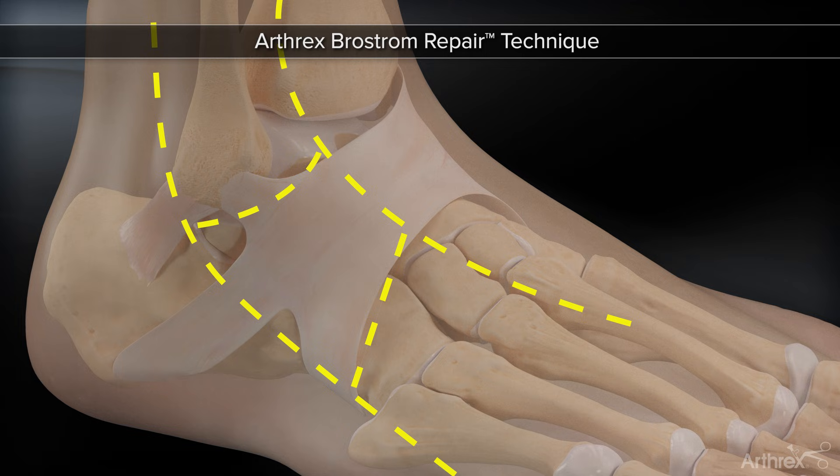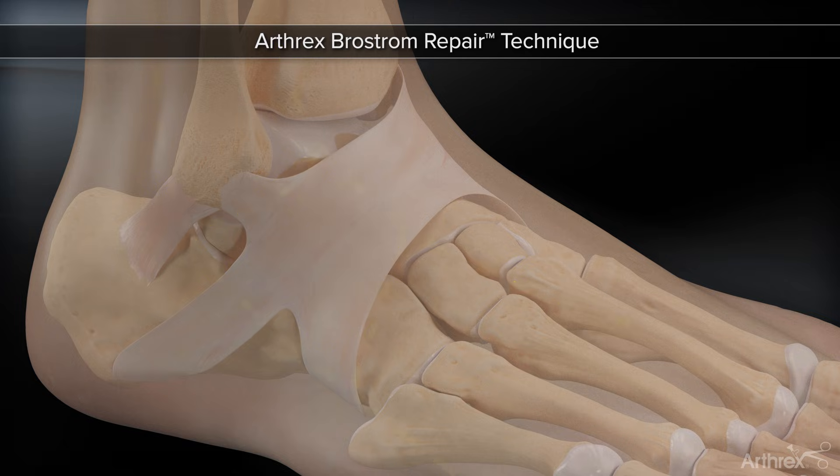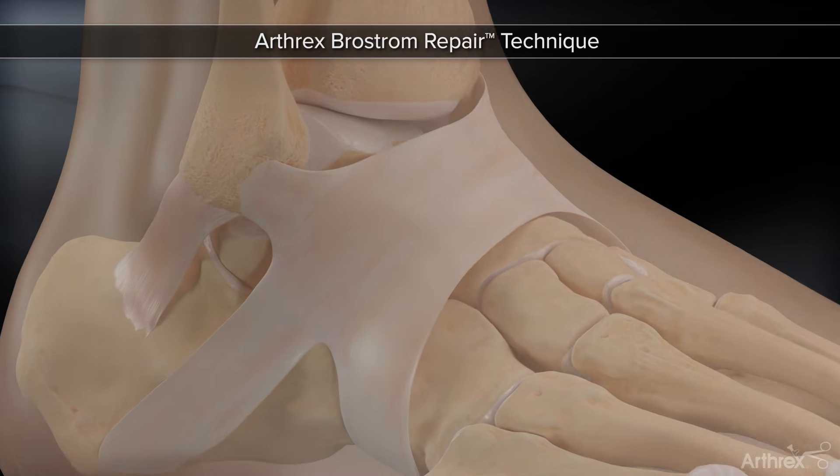After determining the safe zone from the distal tip of the fibula between the superior border of the peroneal tendons and the intermediate branch of the superficial peroneal nerve, the exit points for the suture lasso are mapped out.